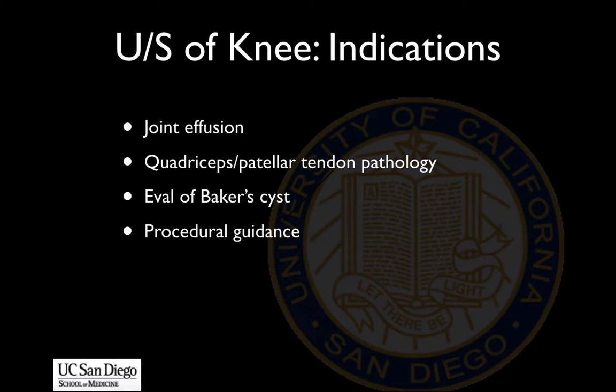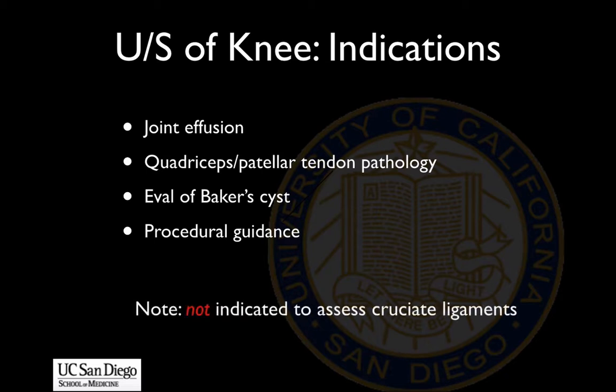In addition, ultrasound of the knee lends itself to procedural guidance to aspirate fluid, inject steroids, and things of that sort. Now, one thing to keep in mind is that the knee ultrasound exam is ideal in many respects. However, there are shortcomings. It's important to realize that ultrasound of the knee is not indicated for definitive assessment of the cruciate ligaments. And I'd like you to ponder that for just a moment as to why.